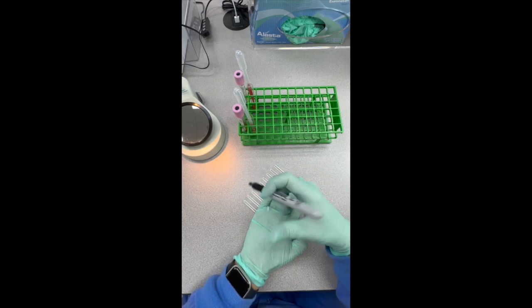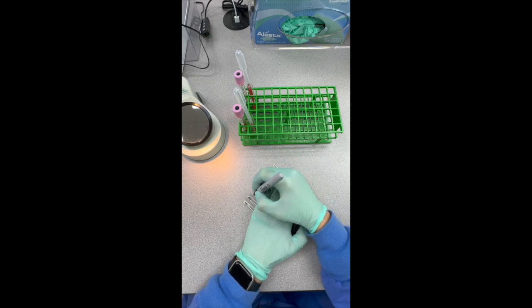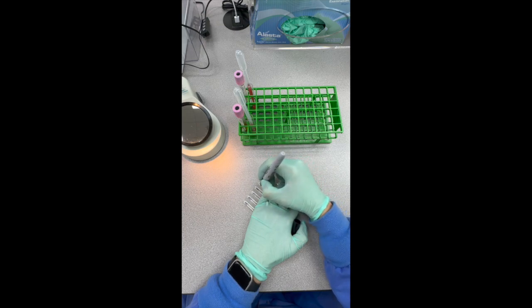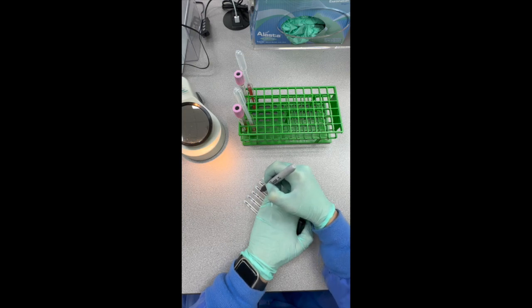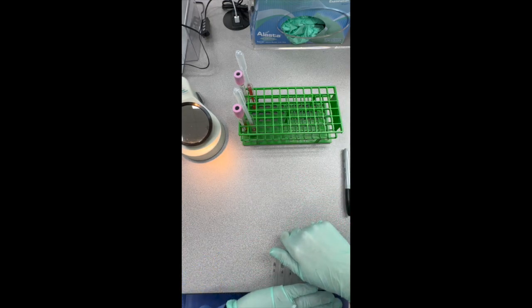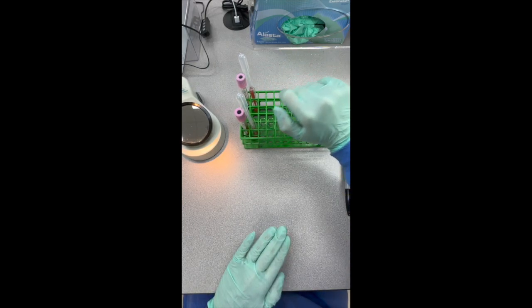So the way we label these, remember, capital A, capital B, capital D. We'll do our capital C for our RH control, a lowercase a1, a lowercase b, and then our patient tube. And I'm going to go ahead and put an H on all of these tubes for my one patient so I can keep those straight. I don't want to get my patients mixed up because we're going to be looking at two patients together today. So slide those to the edge, put them in my rack.